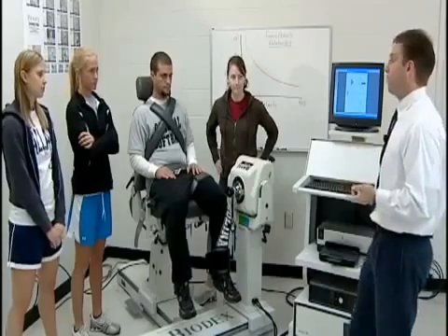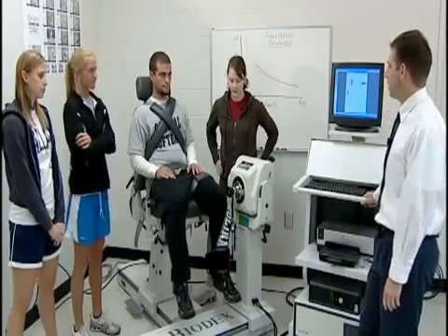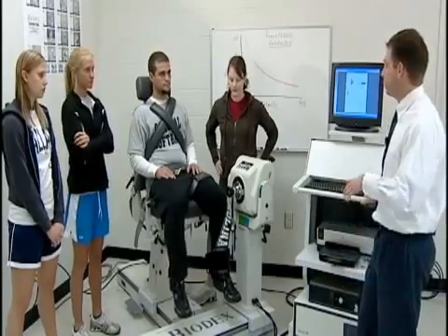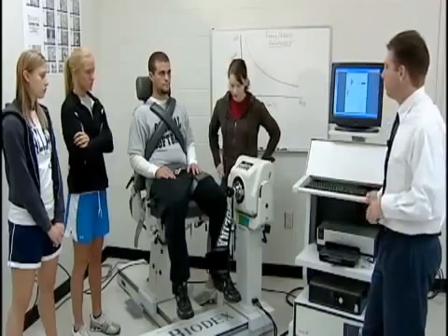Why would we test quadriceps versus hamstrings — what could a muscle imbalance on one side of the limb potentially do? It can cause injury. Anterior cruciate ligament tears, one of the most common knee injuries in athletics, are in many cases caused by a muscle imbalance between the quadriceps and the hamstrings. So we're going to test both of those muscle groups at multiple speeds.